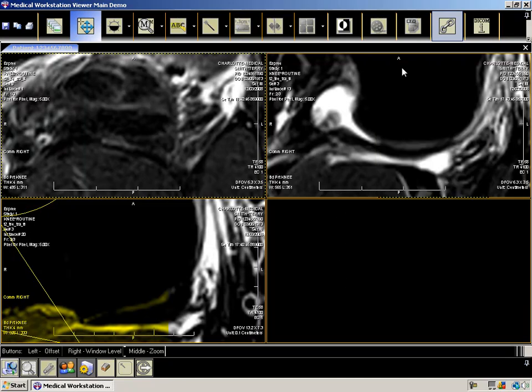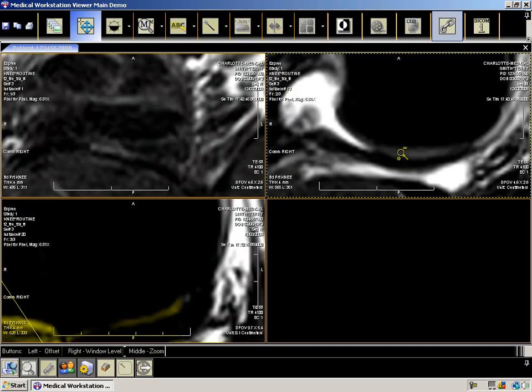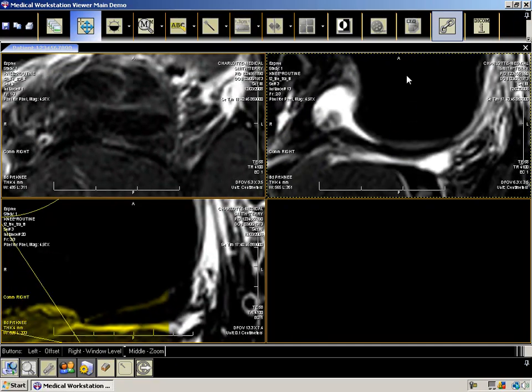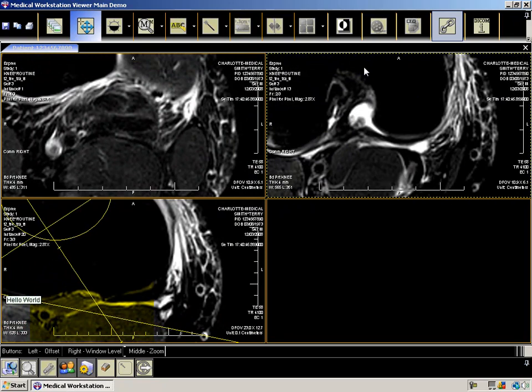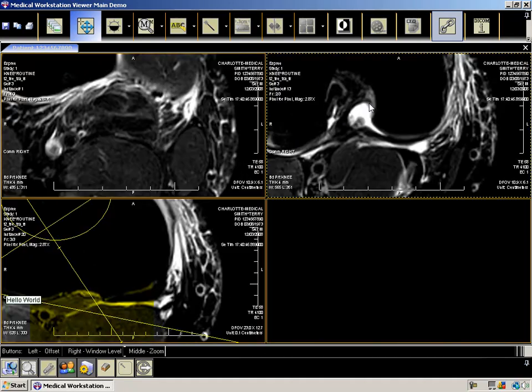For quick zooming, press the middle mouse button and move the mouse up and down. Lastly, if you double-click on any image, you toggle between stack view and series view. This concludes the overview of our medical viewer's functionality. Thanks, everyone.